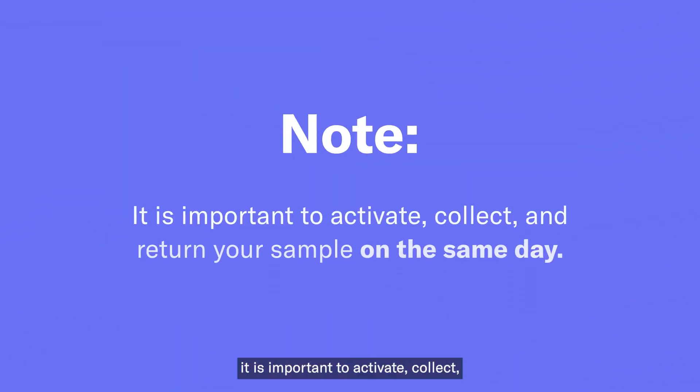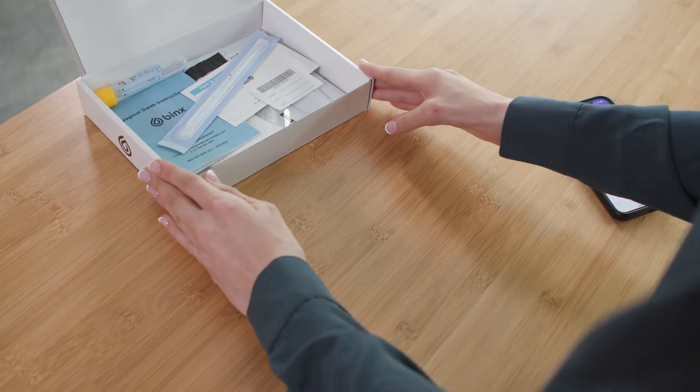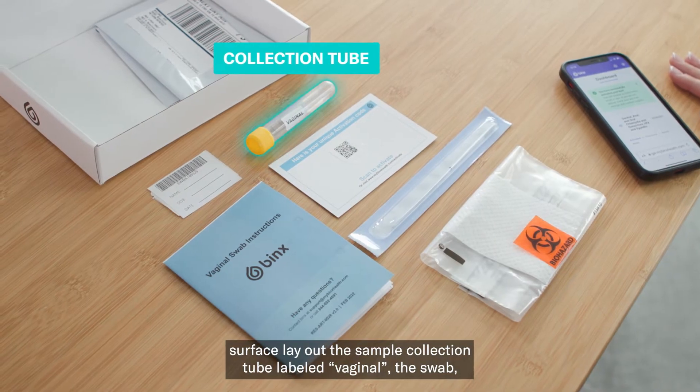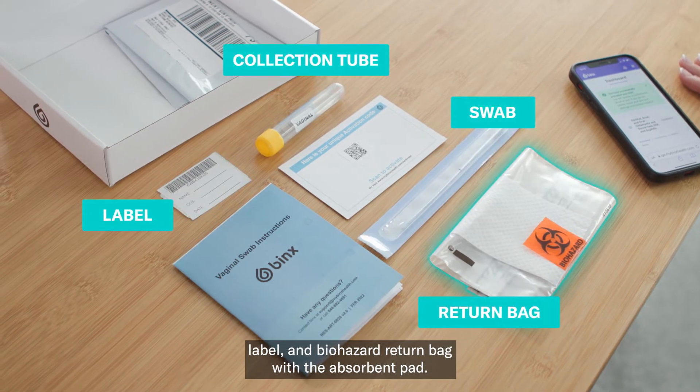It is important to activate, collect, and return your sample all on the same day. Open up the kit and on a clean, flat surface, lay out the sample collection tube labeled vaginal, the swab, label, and biohazard return bag with the absorbent pad.